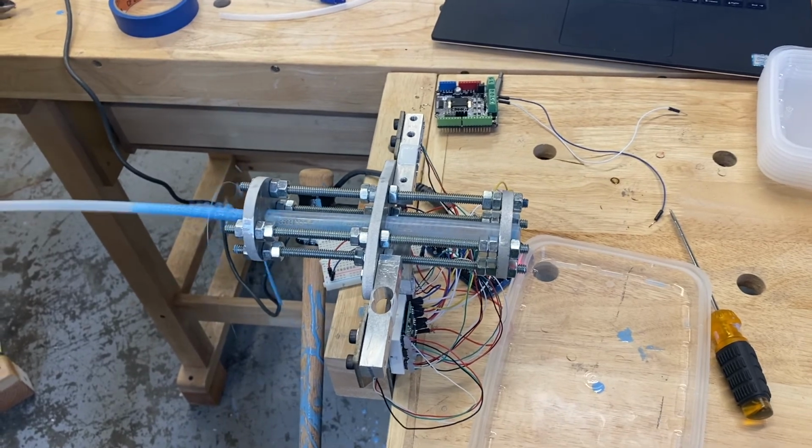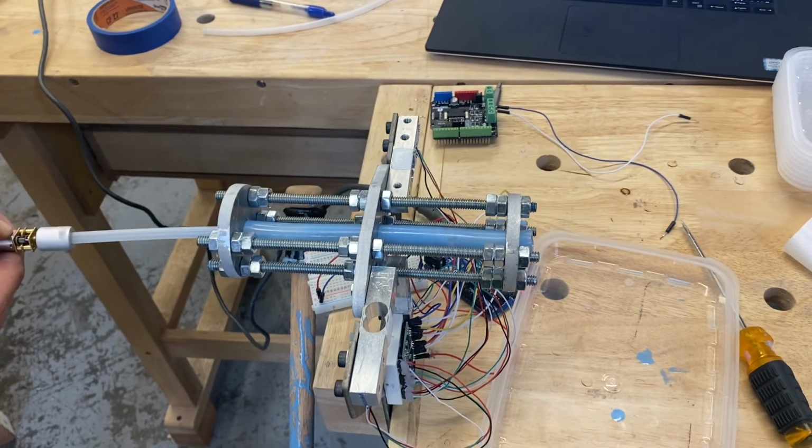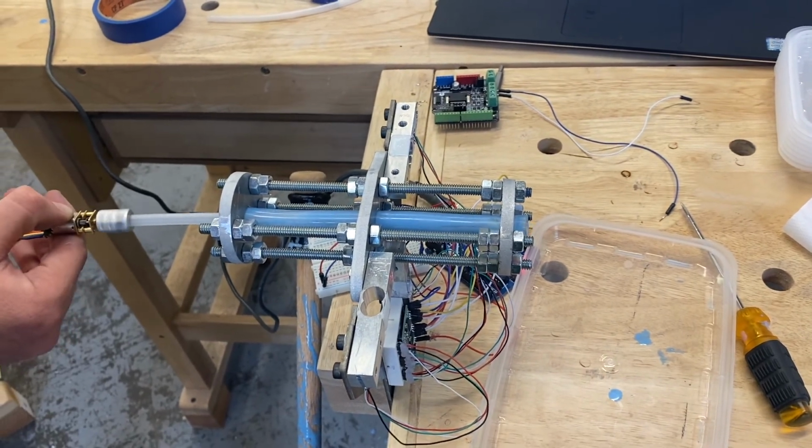The device was turned on and passed through the section of tubing, which took about 8 seconds on average. The cleaned tube was then weighed. The clean weight, the filled weight, and the empty weight were used to determine the percentage of removal. This number was used to evaluate the effectiveness of the device at mass removal.